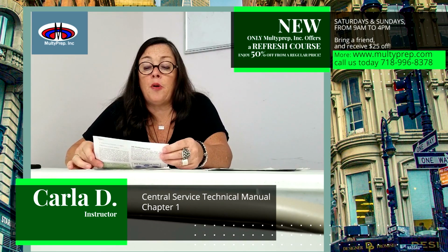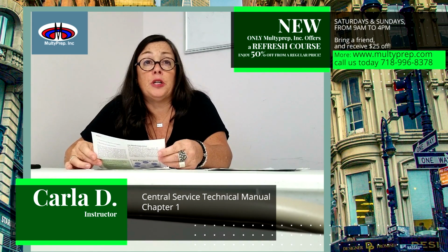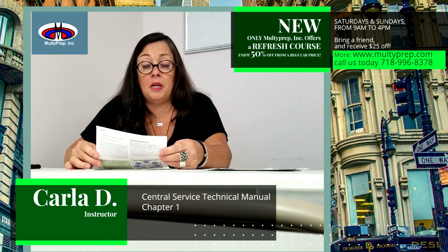Personnel working in the preparation, package, and sterilization areas of central service must wear facility-restricted attire, such as a scrub suit and hair coverings. It is essential that CS professionals diligently adhere to the dress codes and safe work practices to protect the environment from contamination.